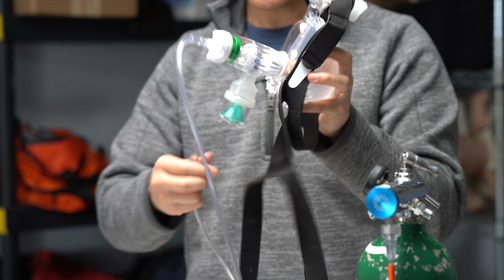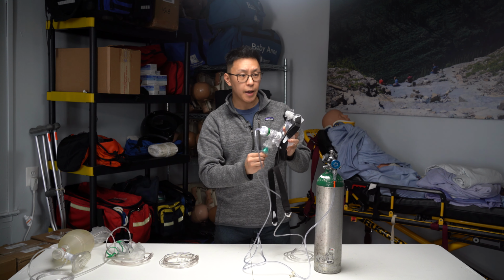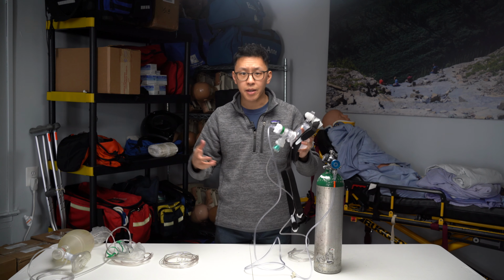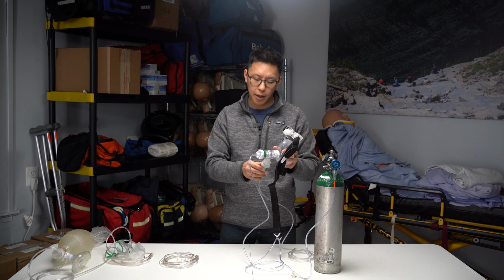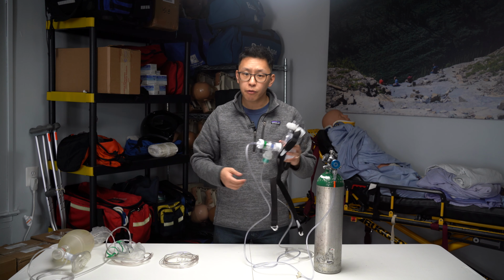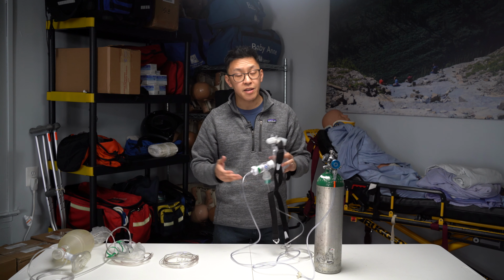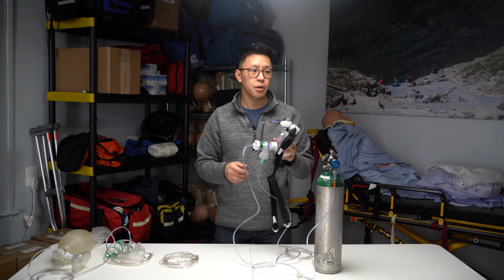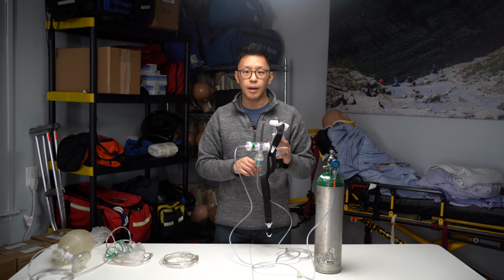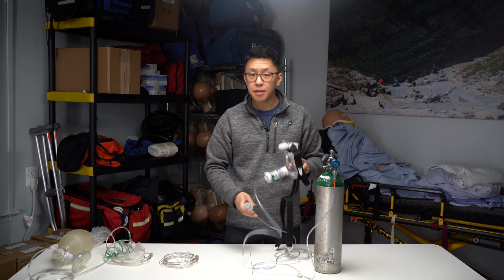Now we would need a second oxygen tubing for that, which would imply a second oxygen tank. So be mindful, if you have severe respiratory distress with wheezes, after a couple rounds of a nebulizer, you might have the opportunity to escalate to albuterol via CPAP, okay? So that's the third indication.